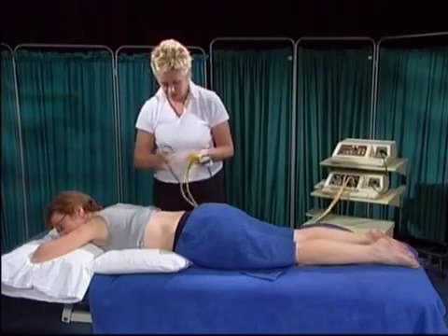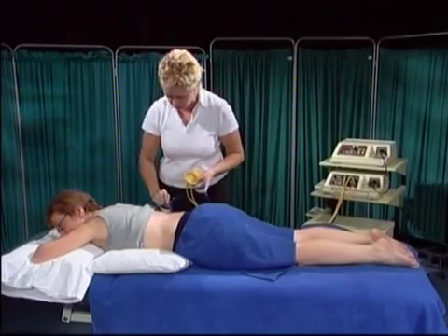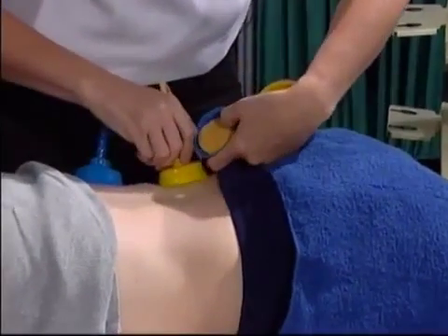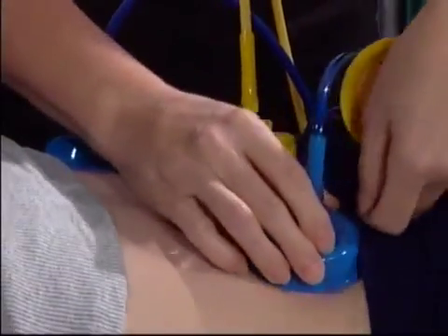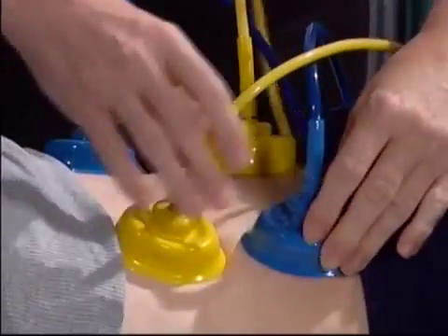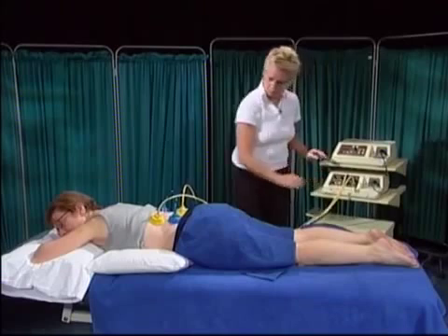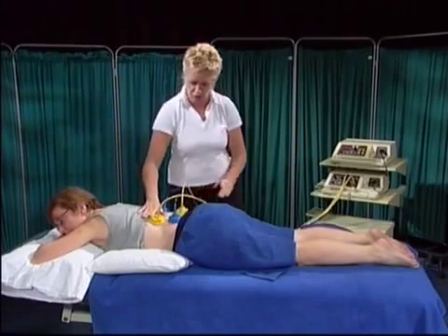So we're going to put some suction cups on your back. It might feel a little bit cold because the sponges are wet. The same coloured leads and suction cups need to be applied diagonally opposite to each other, so that the two medium frequencies interfere with one another and generate the desired low frequency effect appropriate for the condition being treated. Does that feel alright? That's just going to feel that that's the suction of the machine, that's not the actual treatment.